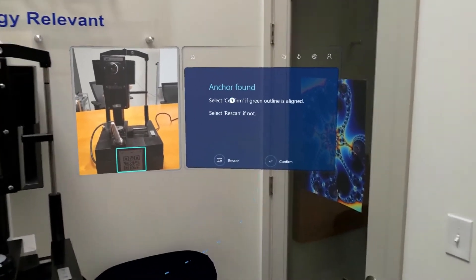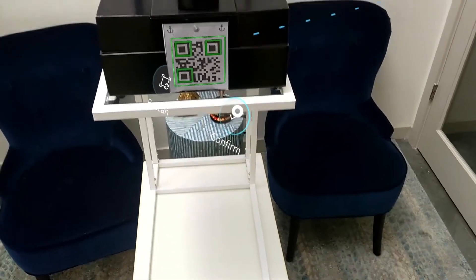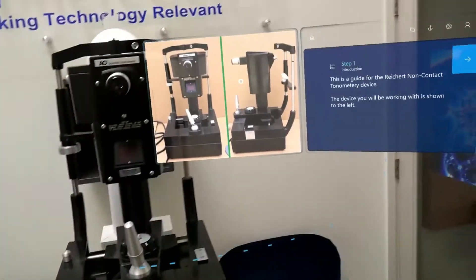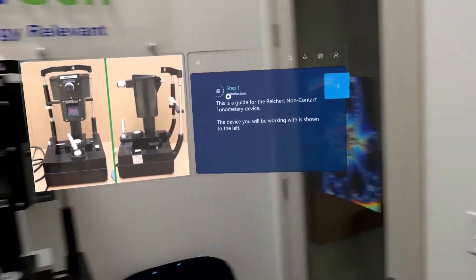We're being asked to find the anchor and select confirm. Here we have a QR code we're going to use as an anchor point for this guide. It should be noted that if this anchor point were placed on the same piece of equipment anywhere in the world, this guide would operate exactly as you're seeing now.